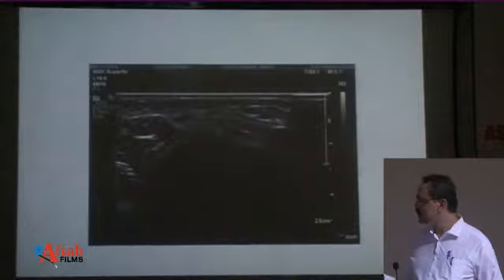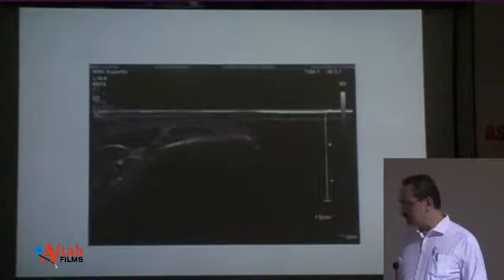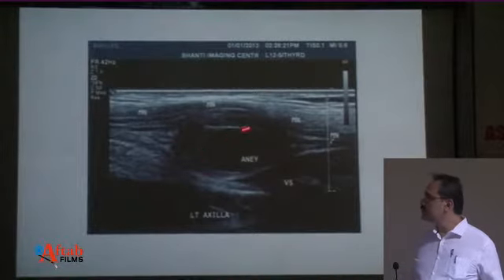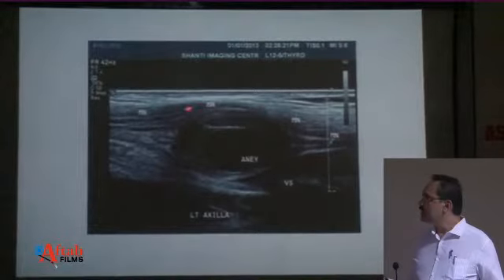The video is not working, but it will show the subluxation of the ulnar nerve in this image. This is the ulnar nerve, which is edematous. There is another case which is showing injury to the vessel and the pseudoaneurysm formation, and it is compressing the median nerve at this level.